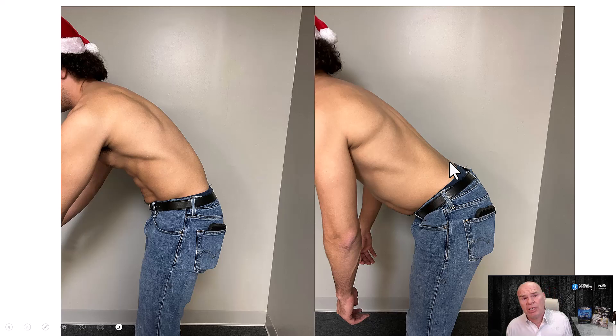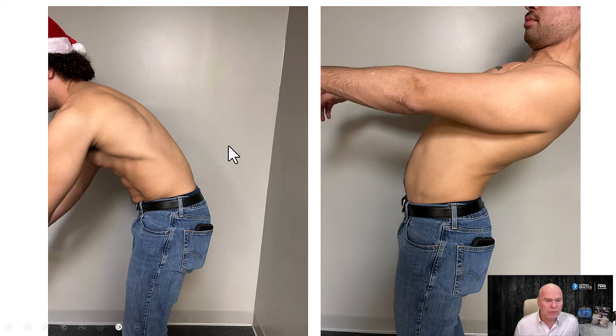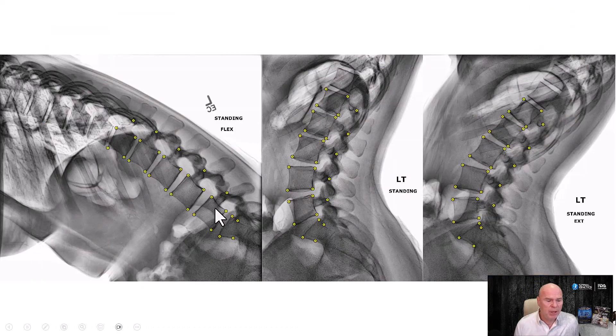This is sometimes a posture the patient adopts because it's painful and they can't get into proper position. If that's the case, you have to treat them for a while and then shoot these shots. You should see a C curve in flexion and a backward curve in extension, just like shown here.